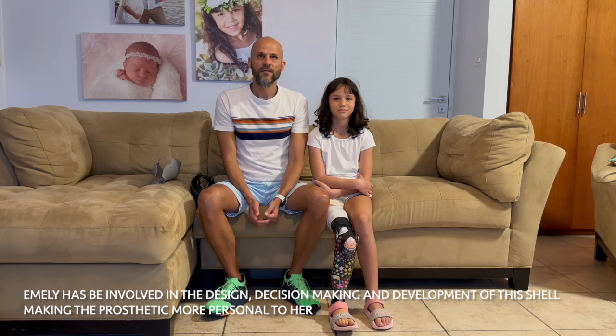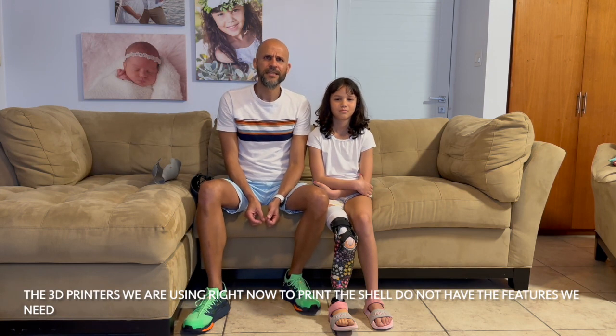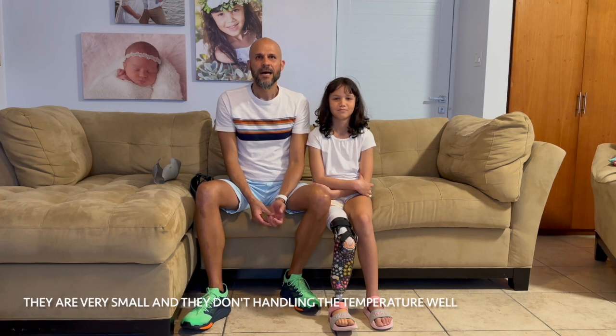Emily has been involved in the design, decision-making, and development of this shell, making the prosthetic more personal to her. The 3D printers we are using right now to print the shell do not have the features we need. They are very small and they don't handle the temperature well.